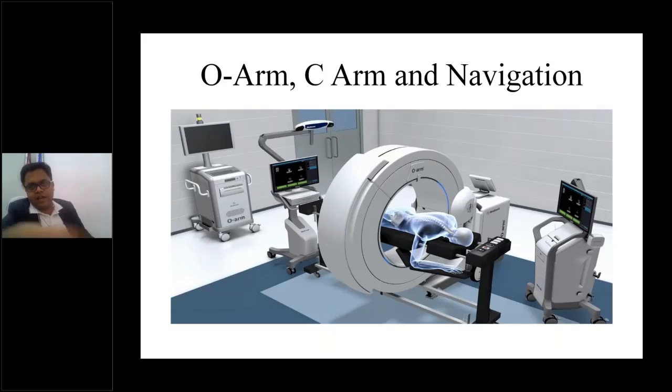Now, my orthopedic residents have been using the C-arm since a long time, and a lot of my friends, especially in NHL, had used navigation there, especially for TKR, and I'm not sure if they have incorporated it in spine surgeries or not. But C-arm and navigation have been used since a long time. However, the O-arm is a relatively new technique, and a number of companies are working these days who are trying to build artificial intelligence into this C-arm and O-arm to reduce the exposure.